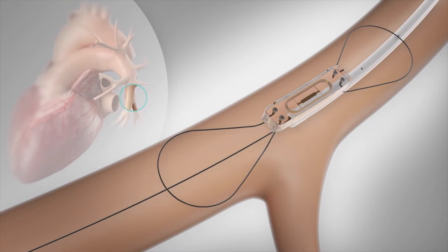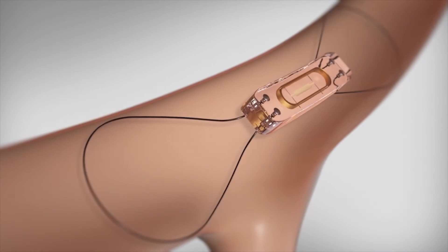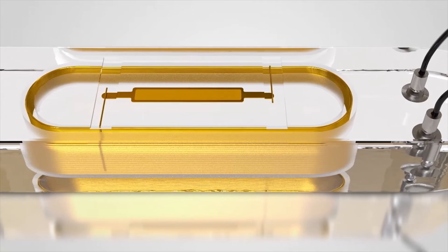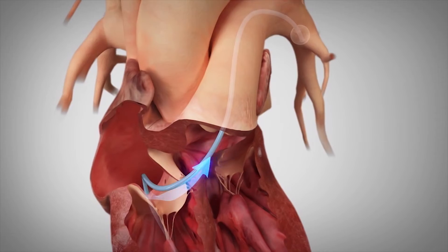The nitinol loops stabilize the sensor in the vessel. On average, the sensor occupies approximately 10% of the lumen and endothelializes within three months of implant. The CardioMEMS PA sensor is calibrated during manufacturing.